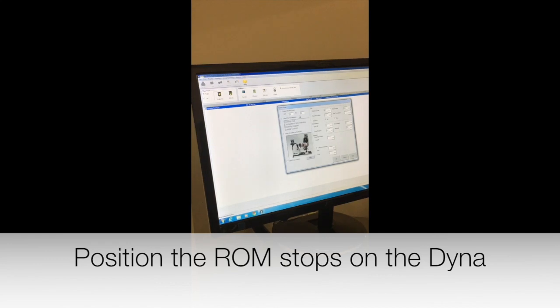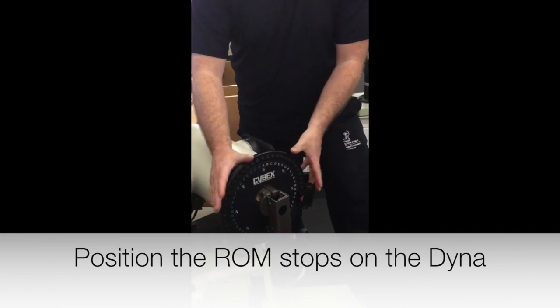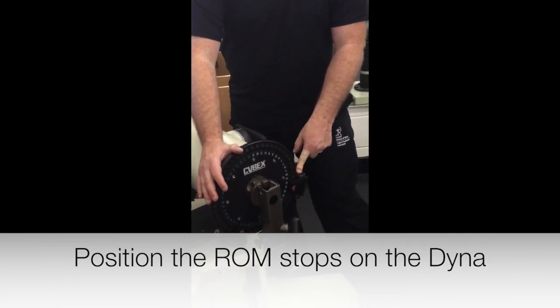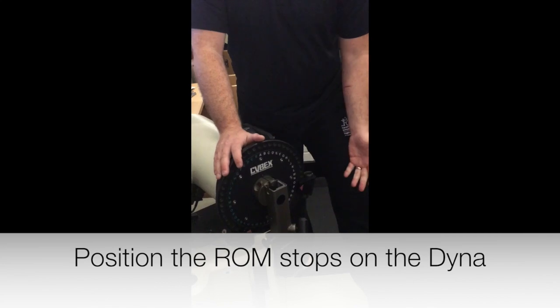So it says position the range of movement stops. These are the range of movement stops. When it prompts you to change or move these, they are the first things you move. These are your safety features. So if you do go beyond range or anything like that, the machine will butt up against that and it just will not go any further.